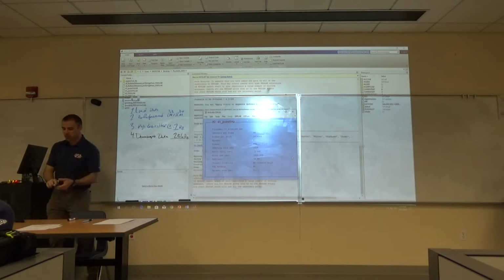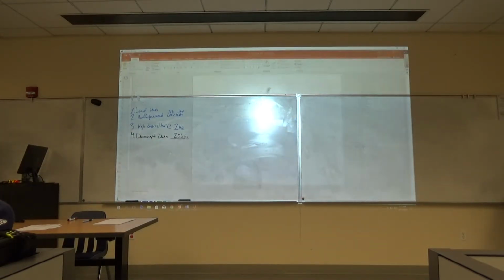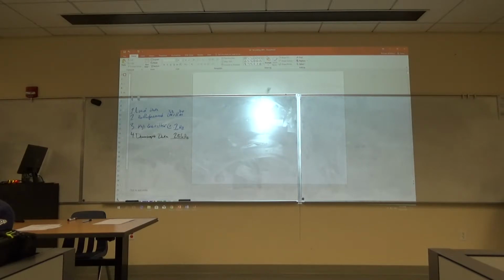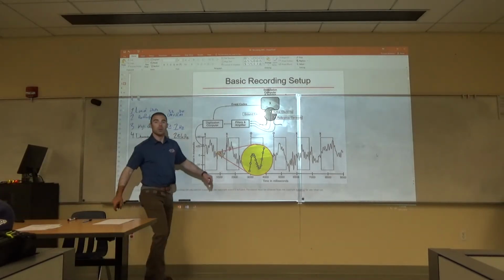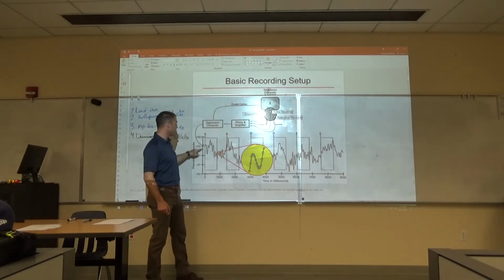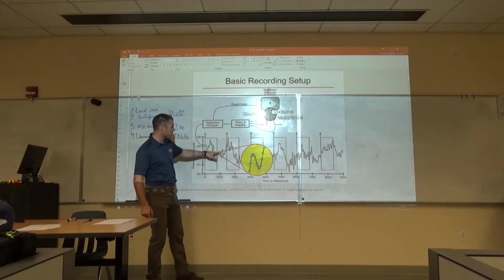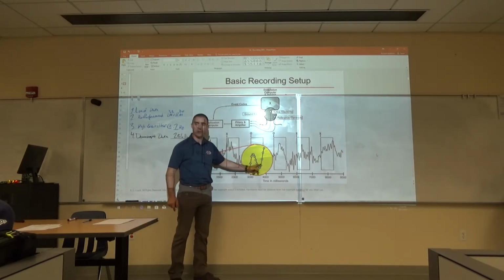Okay, now let's see here. I might have a picture. Let me see if I can bring up a slide real quick. Okay, so this is kind of an example of sampling, right? So we're recording EEG, okay? We've got our event codes, we've got everything coming into our EEG. You grab a little snapshot of data here. And here, you can sample different points. In this case, these little white dots.